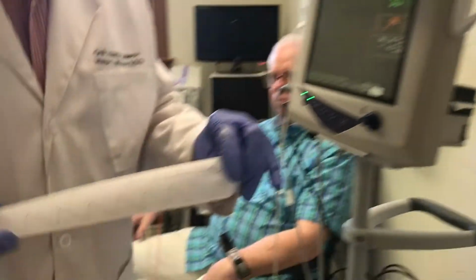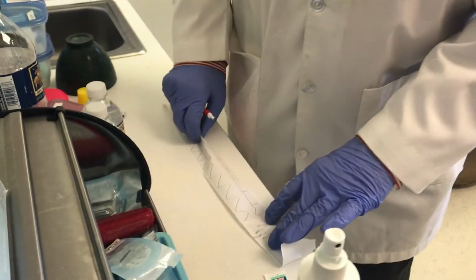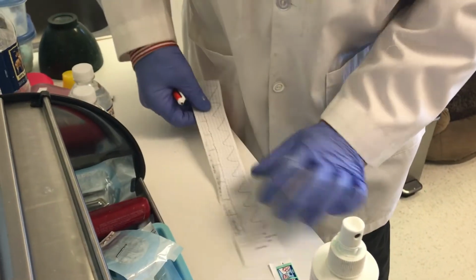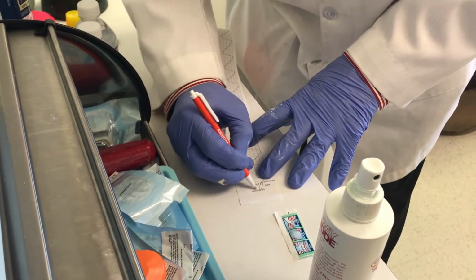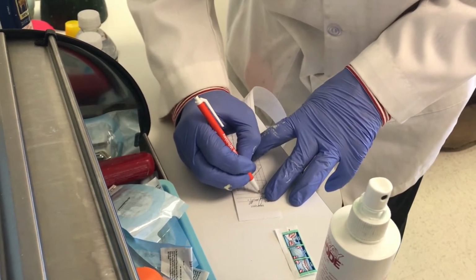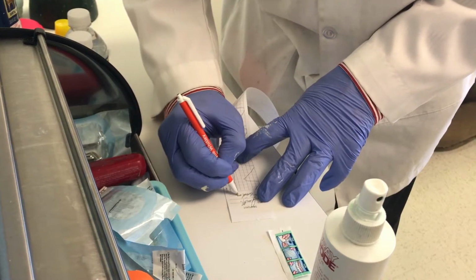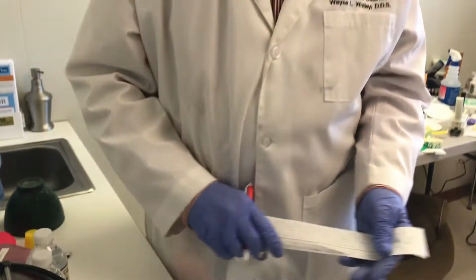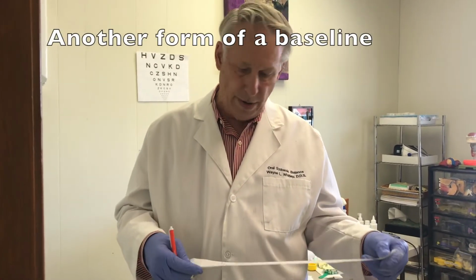So now we have a strip, and it's like a little scroll. This thing's hard to work with. So before I do anything, I'll take a minute and put his name on there. And then I put that this was without, obviously he doesn't have anything, but later I'll be doing strips with an appliance. So I want to see what this thing looks like before I start messing around.